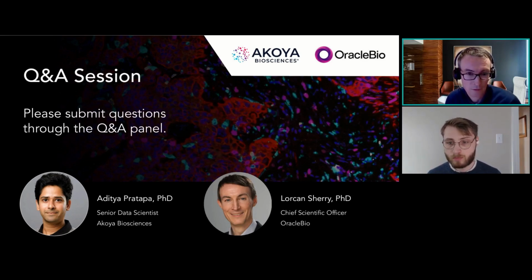And I think that's an important step if you're really wanting to ensure confidence in how those apps are going to perform moving forward. So yeah, I would say trying to build in the validation prior to execution of your actual work samples is an important step.